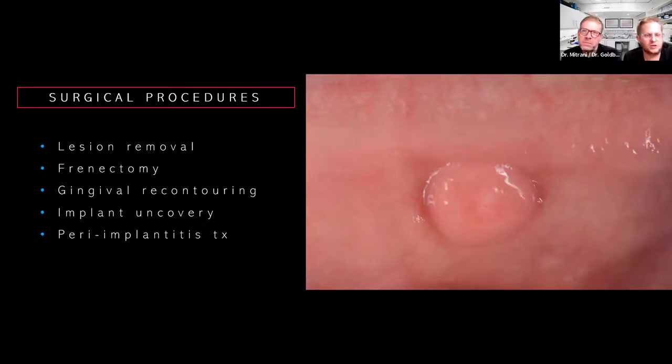Yeah, for sure. And just to clarify, the purpose of today's webinar is to talk about the erbium chromium, which is the water lase; the brand that makes the water lase unit is BioLase. We also use the diode, which is the Epic, and we use it for different purposes. And sometimes we combine both lasers. So today we're mostly going to be focusing on erbium chromium, which is the water lase. So again, going back to the case, we get these lesions, which in most of the cases are because of trauma.